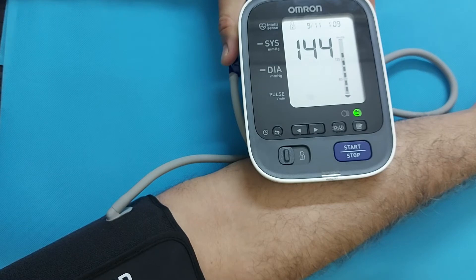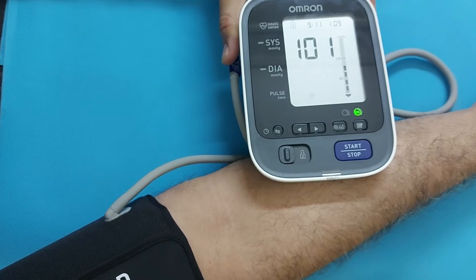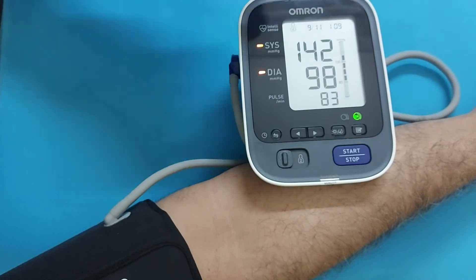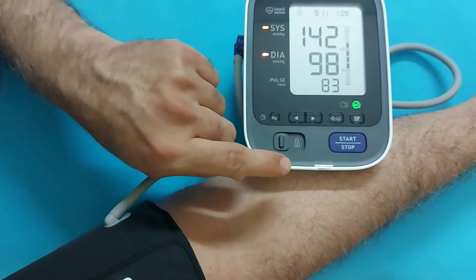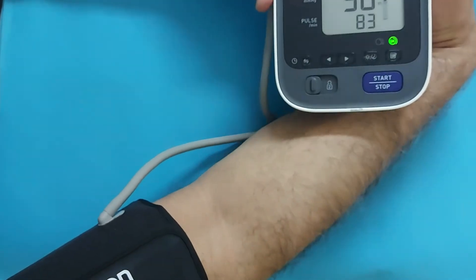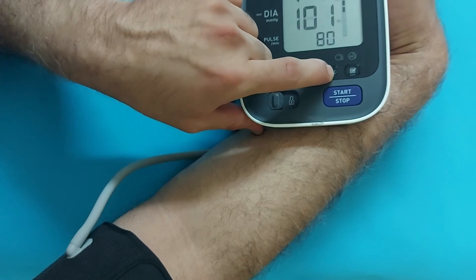Blood pressure readings for both hands are different. When measuring blood pressure with a digital blood pressure monitor, make sure there are no clothes on your arm. The device shows systolic, diastolic, and pulse rate. You can also measure blood pressure for another person, and the data can be saved both in the device and on your mobile phone.